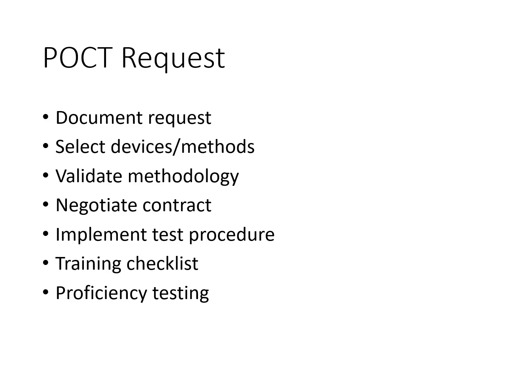Once that is all done, you'll have proficiency testing, hopefully. You want to enroll in proficiency testing. That helps to monitor the accuracy and that the test is still doing what it's supposed to do. You want to conduct regular performance assessments and address deficiencies promptly to help maintain the quality of the test and the results.